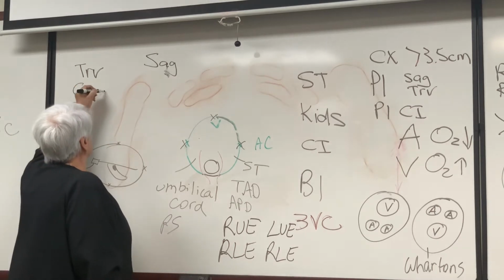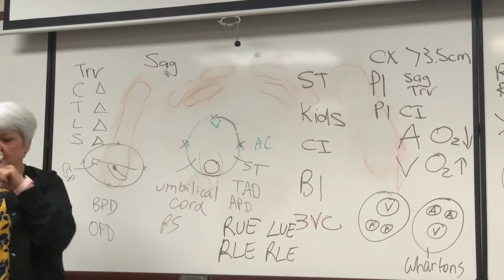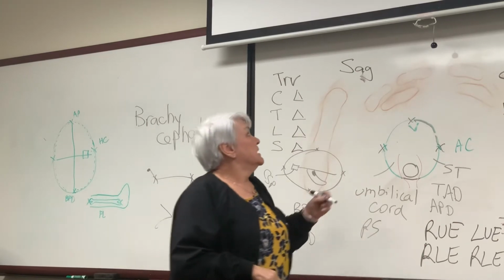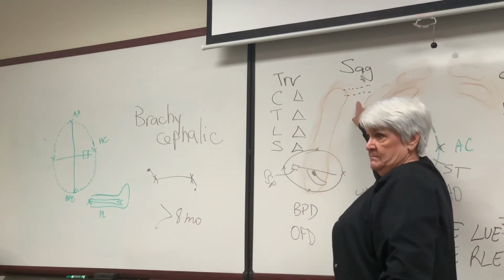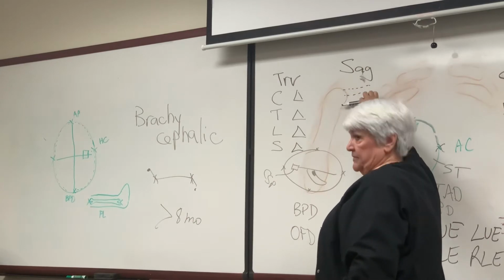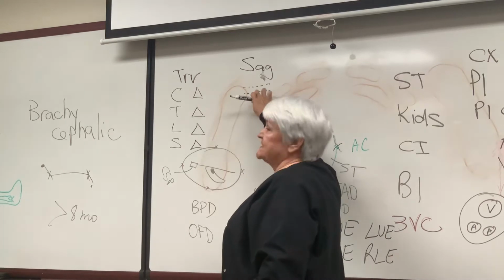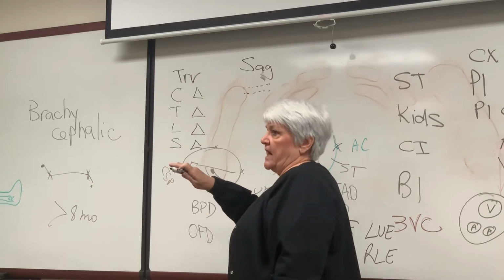Okay, so the images will look like this. I'm going to have little triangles, little teepees. The younger they are, I'm just going to see the dots. For my sagittal, I'm going to look at the base of the skull. How many are there? 7. Railroad tracks. So I'm not on this side of the spine, I'm not on this side of the spine. I'm right parallel with the spine. Because we can tell if you're to one side or the other because it makes that side brighter and, because of physics, it makes it look like one hyperechoic bone.